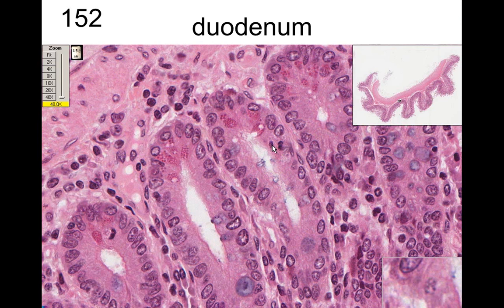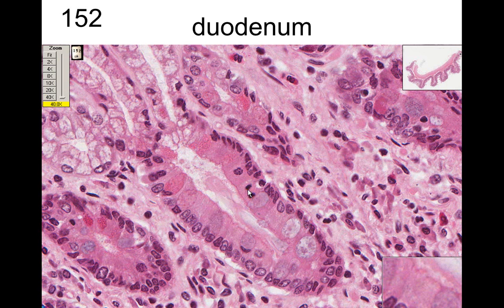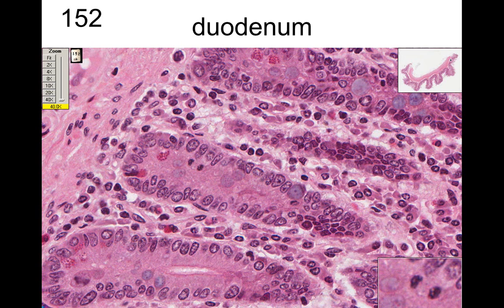Here we see anaphase where two are pulled apart, and another metaphase over here. This is right in the deep part just above the Paneth cells of the intestinal glands where you get mitotic activity occurring. Here's telophase, another telophase, anaphase, telophase. Prophase as we see. These are sections through the cells so it's not the whole cell - it's just a section through it. Another telophase or maybe metaphase.